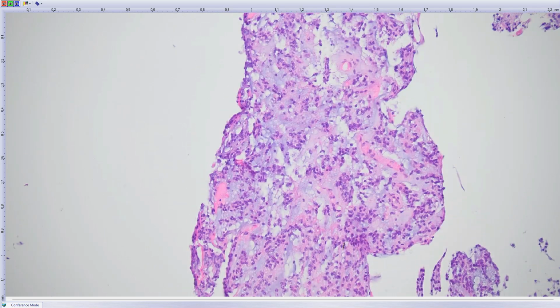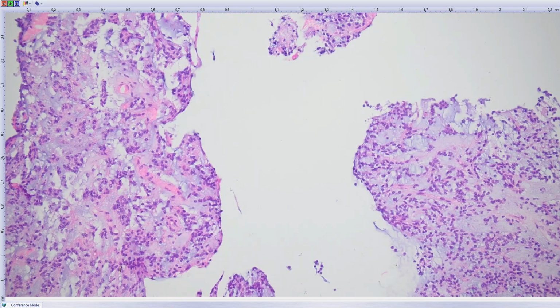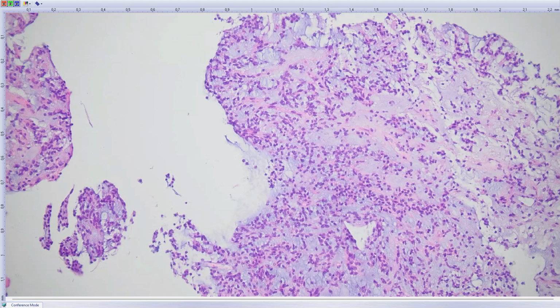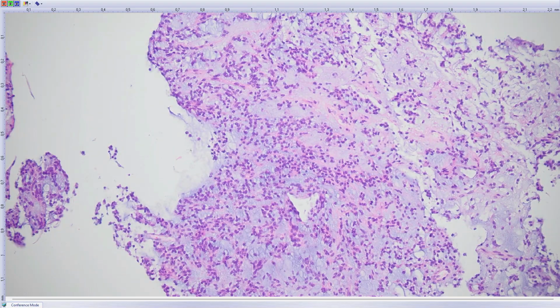astrocytoma. In the previous WHO classification, the tumor was considered rather to be grade 2 compared to conventional pilocytic astrocytoma, which is considered to be grade 1. But in the last WHO classification, we probably should not grade the tumor, and it's probably more like a grade 1 tumor.